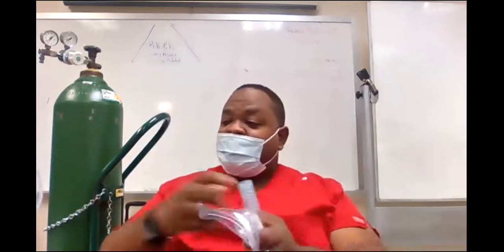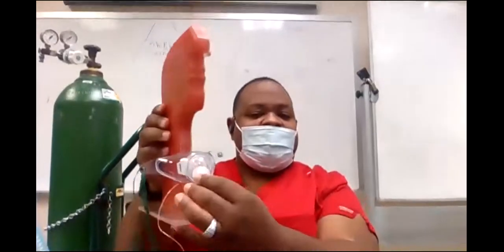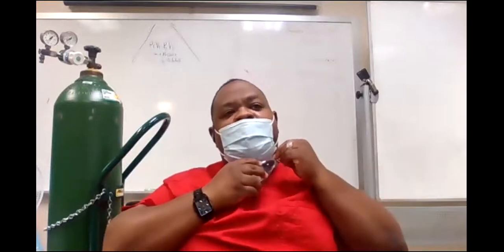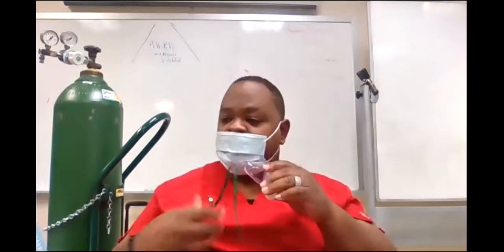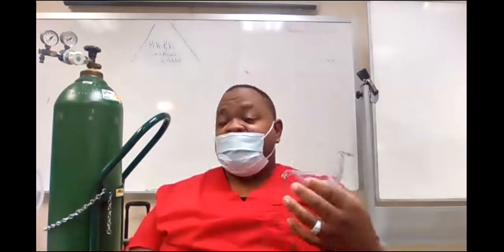If the patient has a tracheostomy, like this gentleman here, then you use what's called a trach mask. This trach mask goes over the trach just like that and then snaps around the back of his neck, okay? It fits right on like this and it snaps on the other side. It's like a little snap thing right here, and that's how it sits. That's a trach mask, okay? It sits right over the trach so oxygen can go in and out the trach with the moisture. So if I put this trach mask on here, this is also known as a trach collar. I call them trach collars. Some people call them trach mask. Same thing.